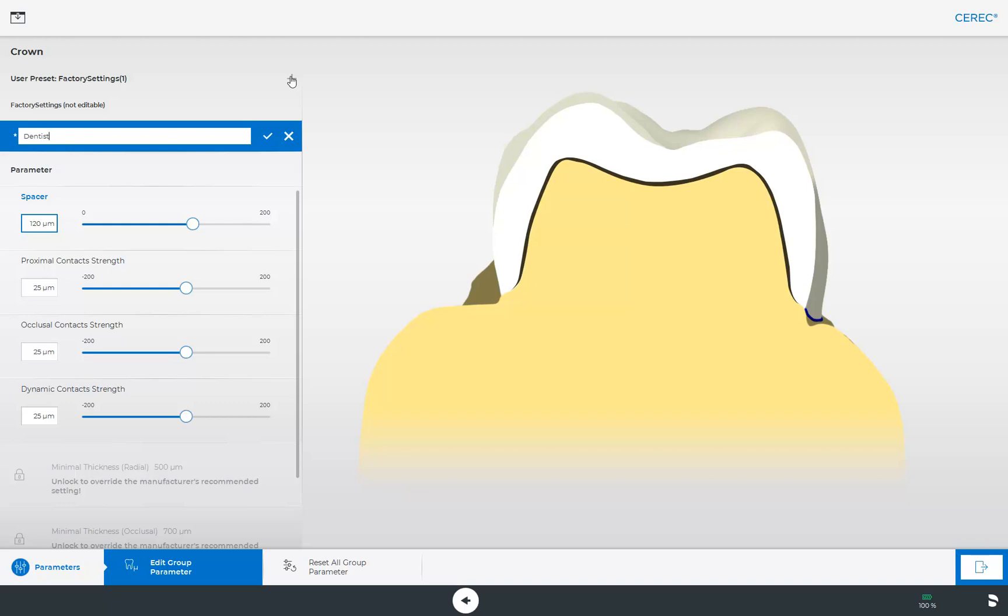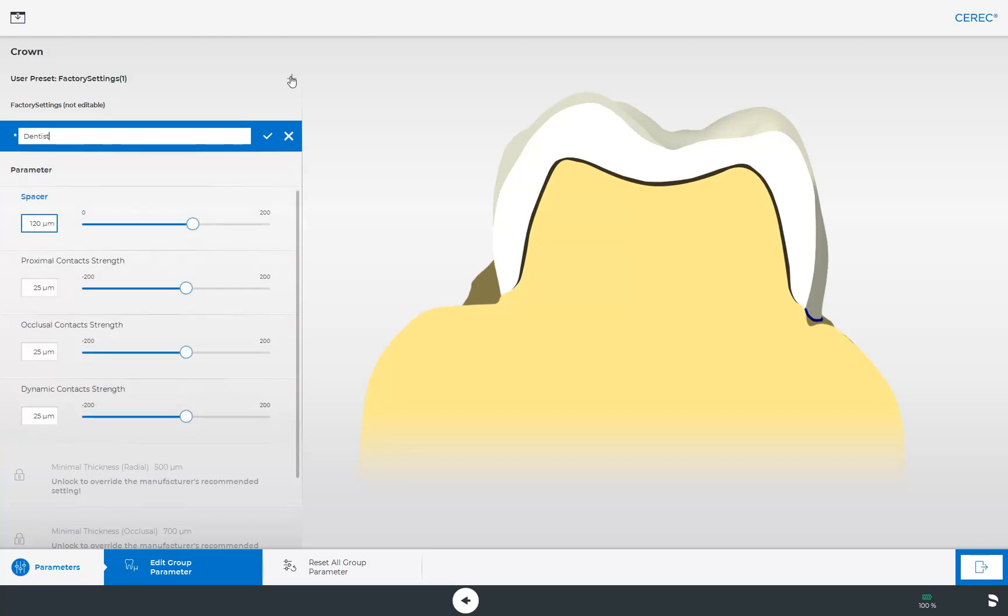Now you can adjust the enabled parameters such as the spacer, the proximal, occlusal, and dynamic contact strength. The settings below that are not activated can also be customized, but you do so at your own risk.